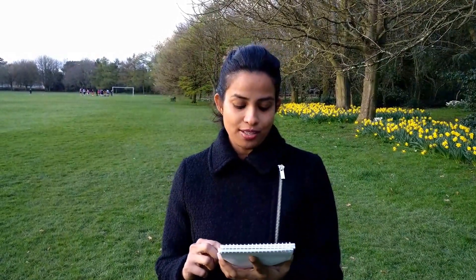For the hand instruments, you need your regular mouth mirror, periodontal probe, straight probe, tweezers, GMT enamel hatchets, and your plastic carrying instruments, amalgam carriers, condensers, carvers, and burnishers. All these are your hand instruments for amalgam.